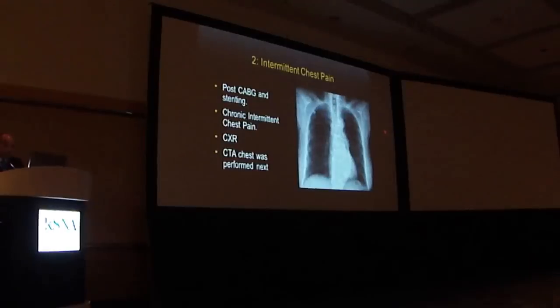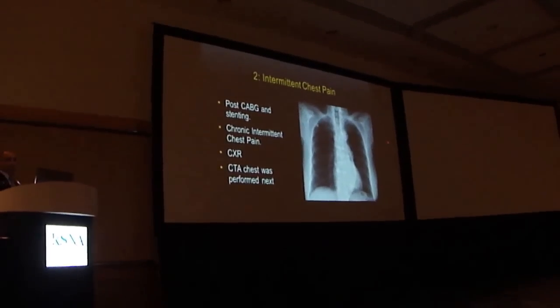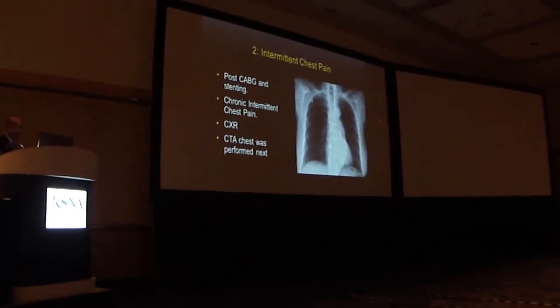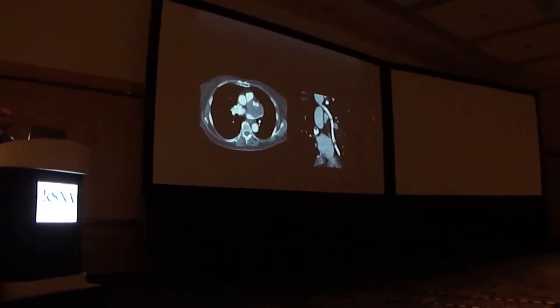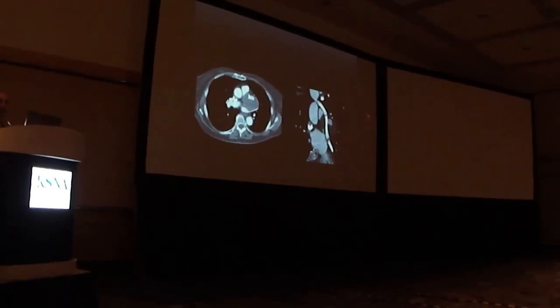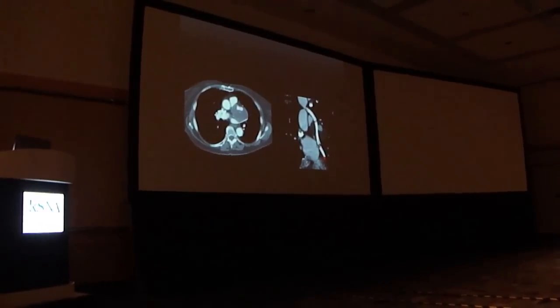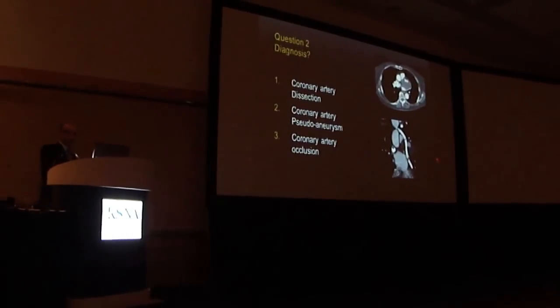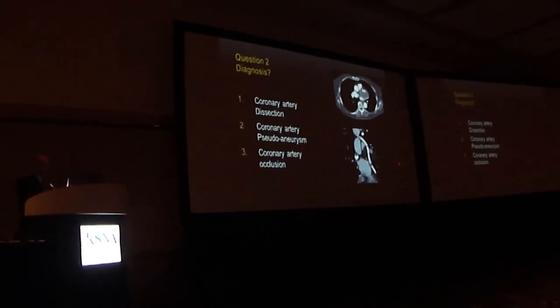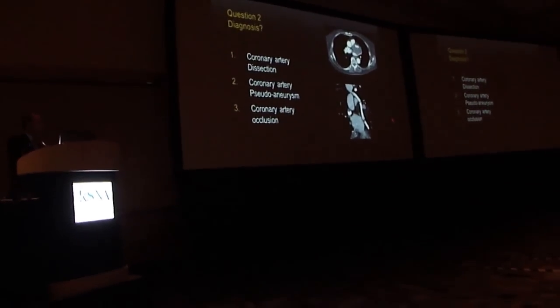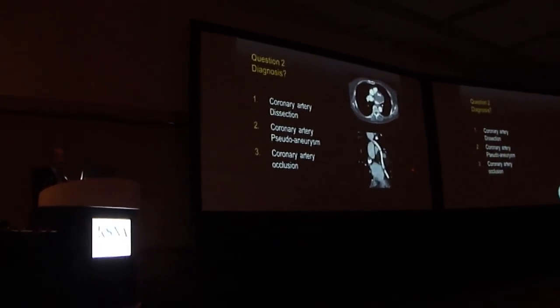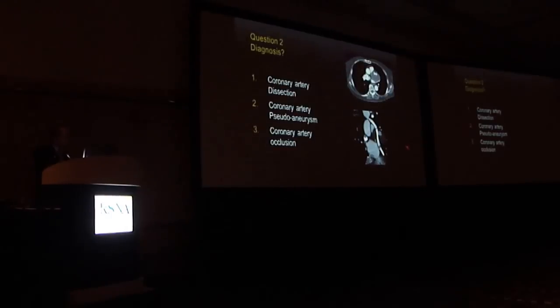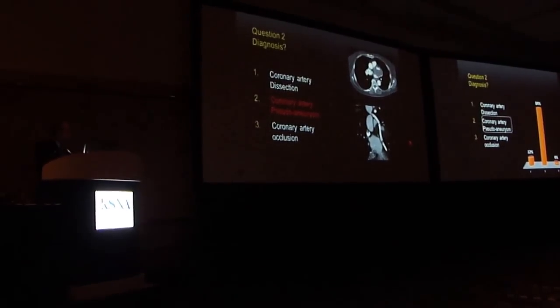Next case: intermittent chest pain. Patient was post-CABG and coronary artery stenting. Chest x-ray was unremarkable and CTA of the chest was performed. You can see three stents and something additional — the stent with a lesion. Differential considerations were coronary artery dissection, coronary artery pseudo-aneurysm, or coronary artery occlusion. 84% correct — not bad.